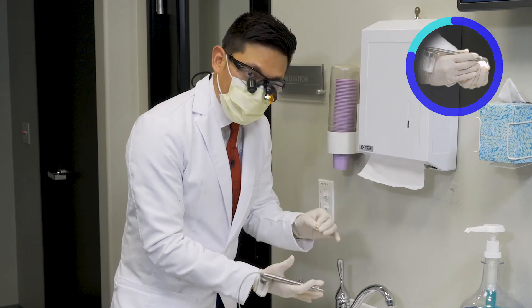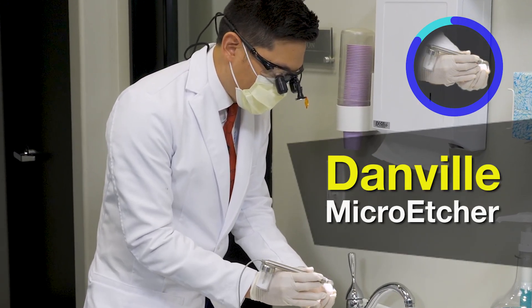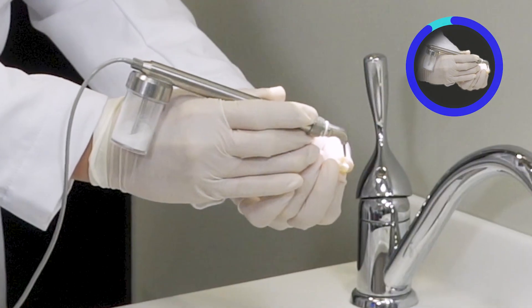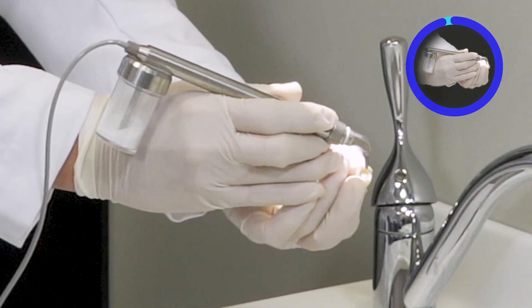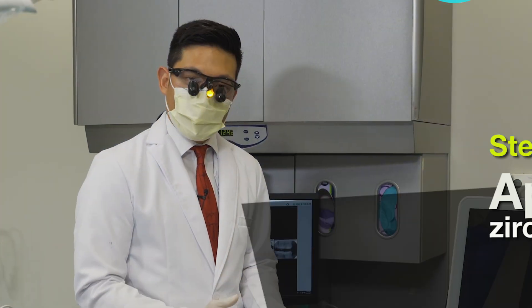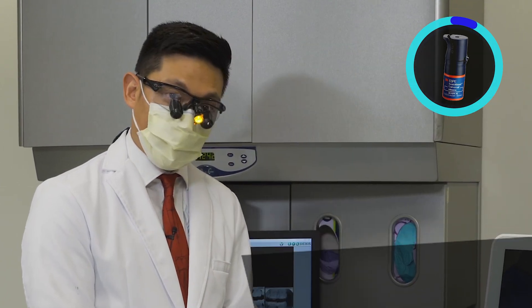So after we've tried it in and confirmed the fit, it has become contaminated. Now we're using this Danville chairside micro etcher and I'm applying this to the entire internal surface. This is a Bruxer Now crown which was milled chairside. So we have our decontaminated Bruxer crown. Now we're going to follow it up with a zirconia primer.